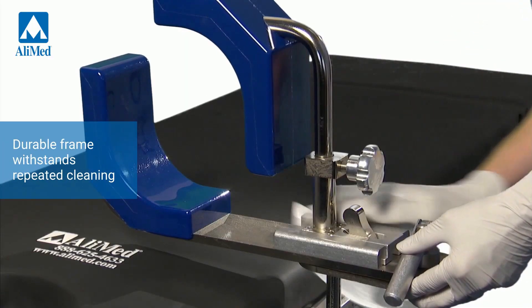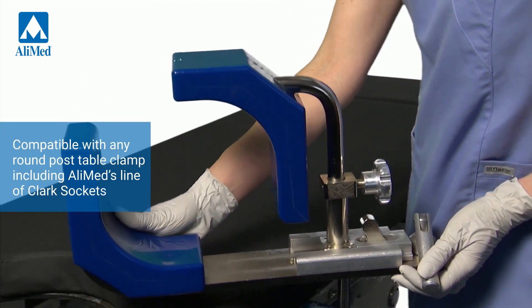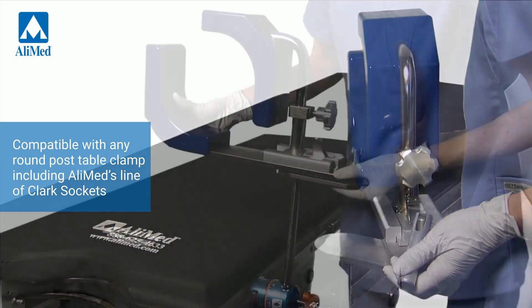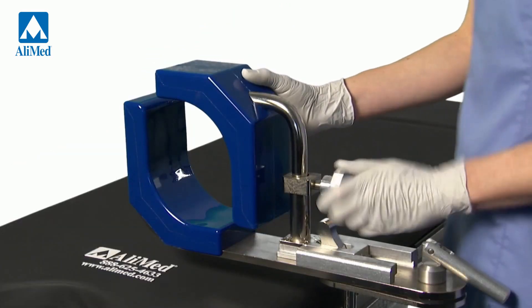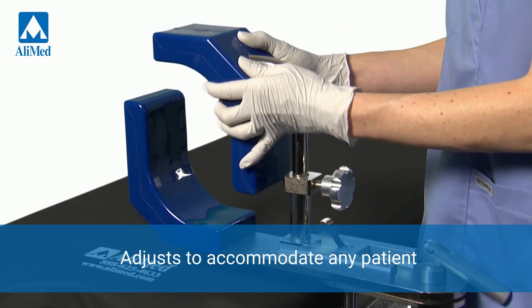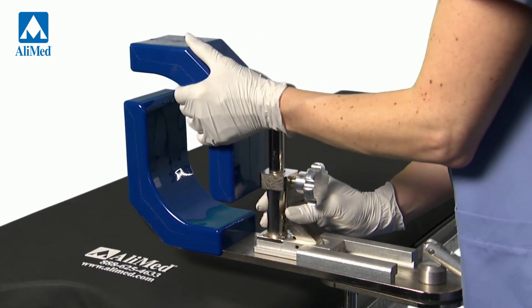The stainless steel frame withstands repeated cleaning, and the low-profile design easily pivots for use on either leg and adjusts vertically to meet your procedural needs. The arthroscopic leg holder accommodates any patient and can be adjusted vertically or horizontally to securely position the operative leg.